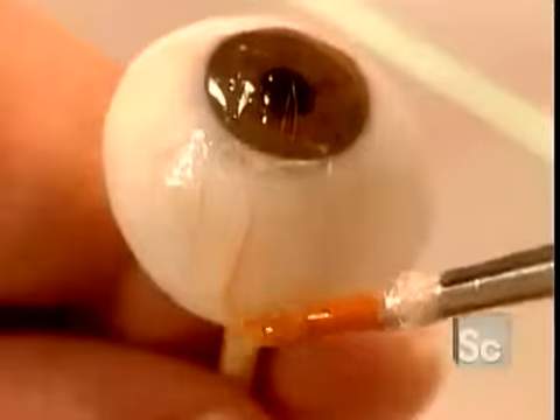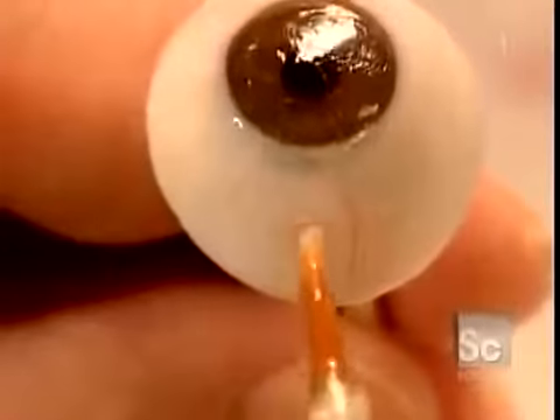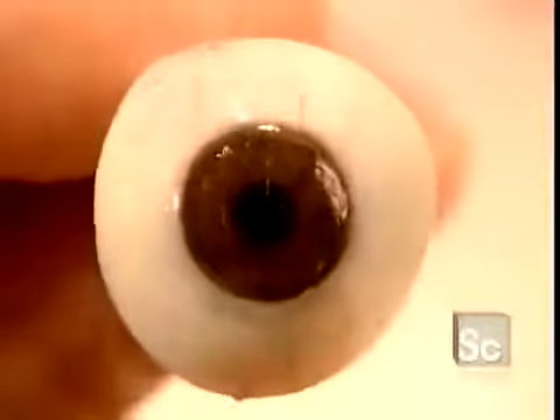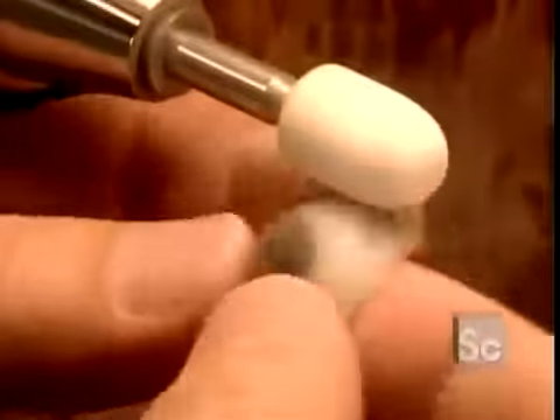To create veins with some dimension, they use the same acrylic coating to stick on some delicate silk threads. Once they're satisfied, the artificial eye is a perfect match. They seal the artwork with another acrylic coating.